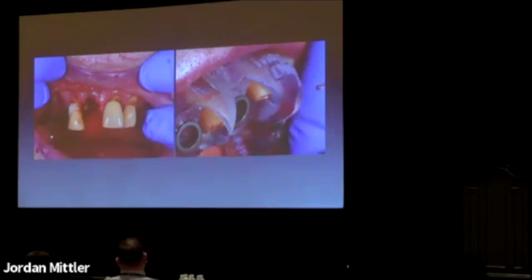We're going to keep 3 of the teeth, because 2 of those teeth were in sites I wanted to place implants. We check the seating of our guide, which seats on those teeth, plus we have palatal support for that guide, so we know we have a really good seat. We're going to place our 5 implants, and then once we do that, we'll remove those 3 remaining teeth, and then we can do our immediate load.